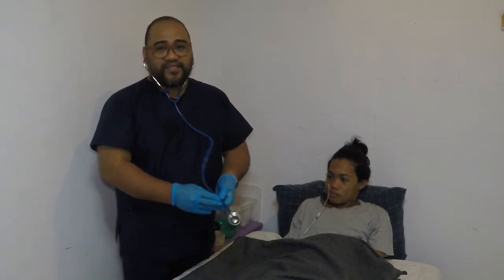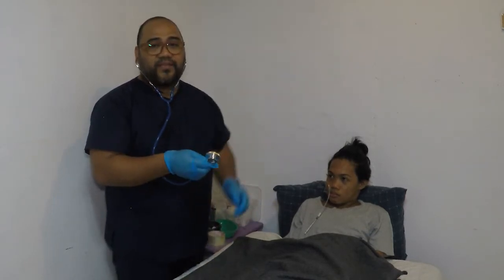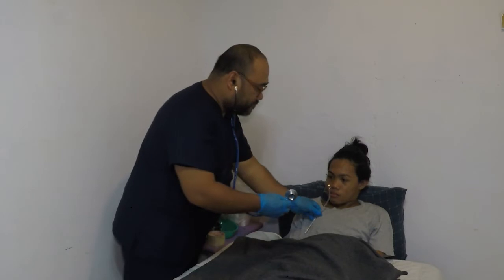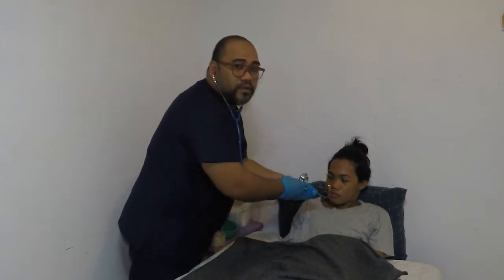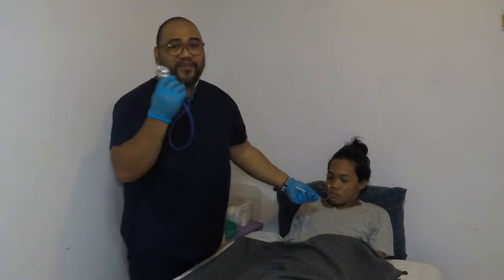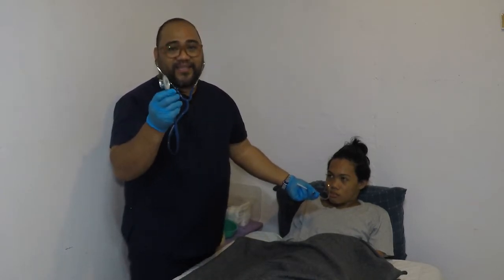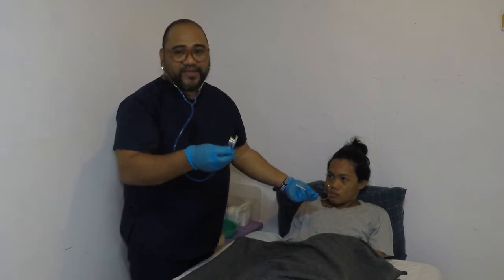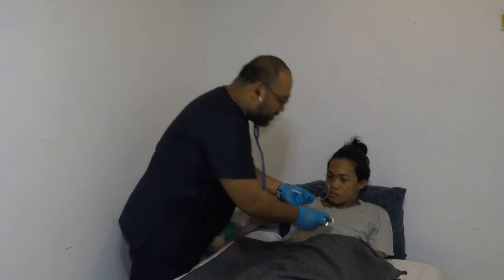For auscultation, inject a small amount of air, 10 to 15 ml, into the nasogastric tube while you listen with the stethoscope approximately 3 inches or 8 cm below the sternum to obtain a gauge of placement of the tube as ordered by the doctor.